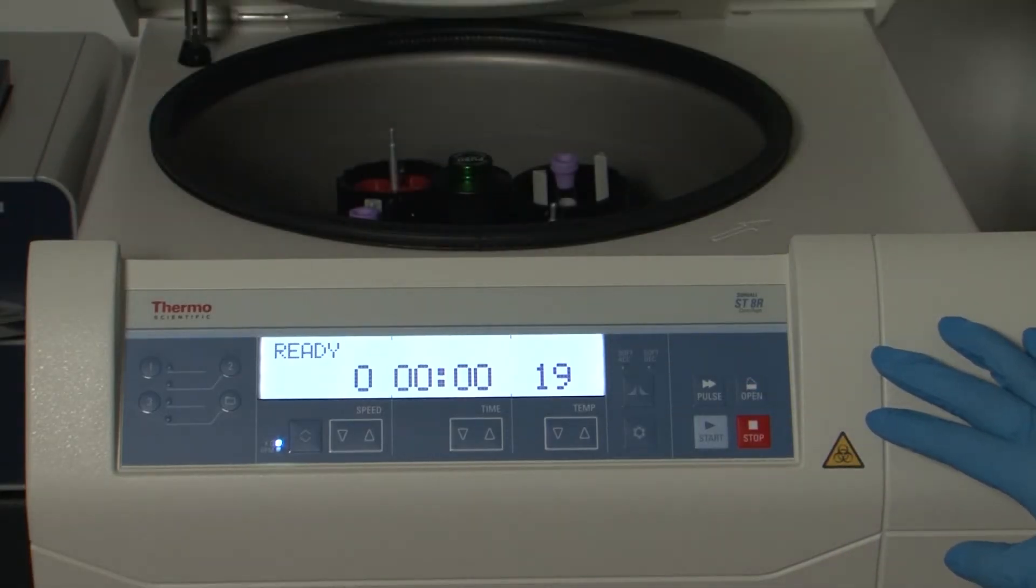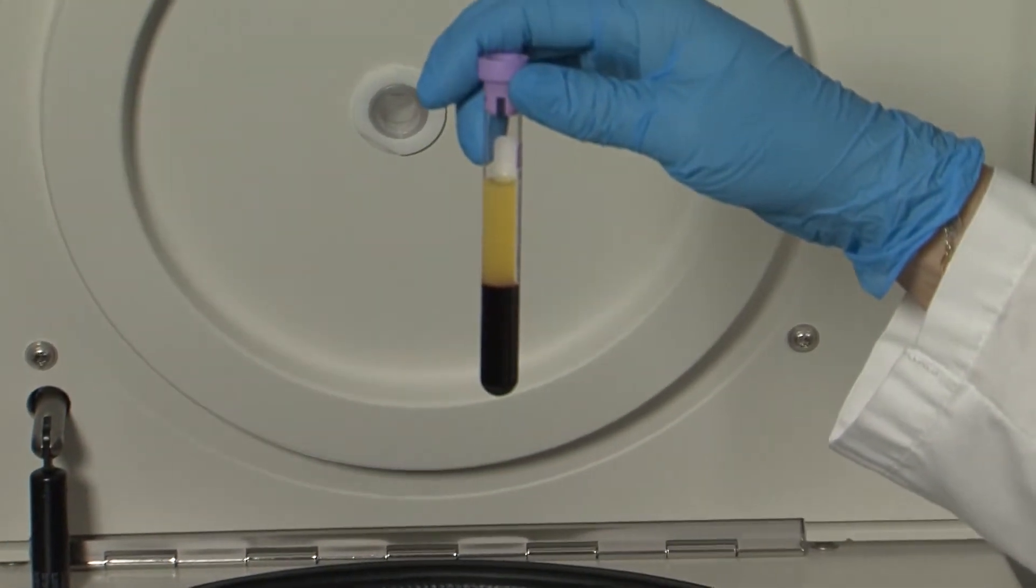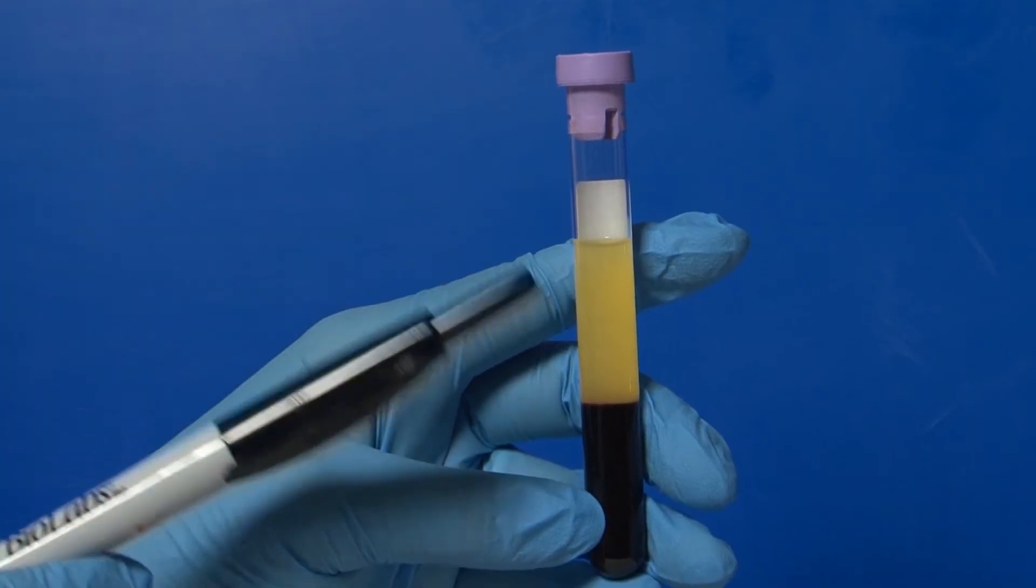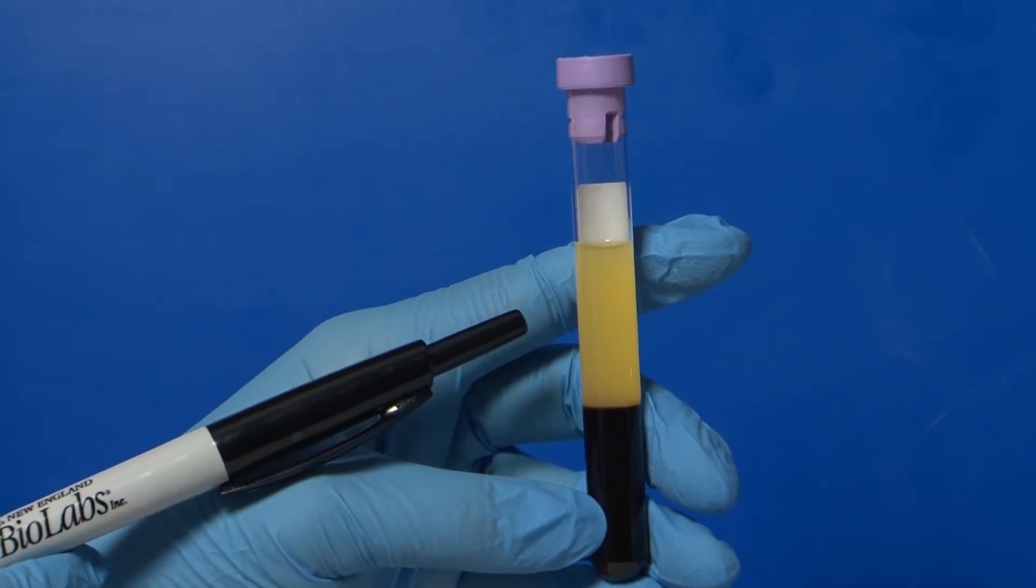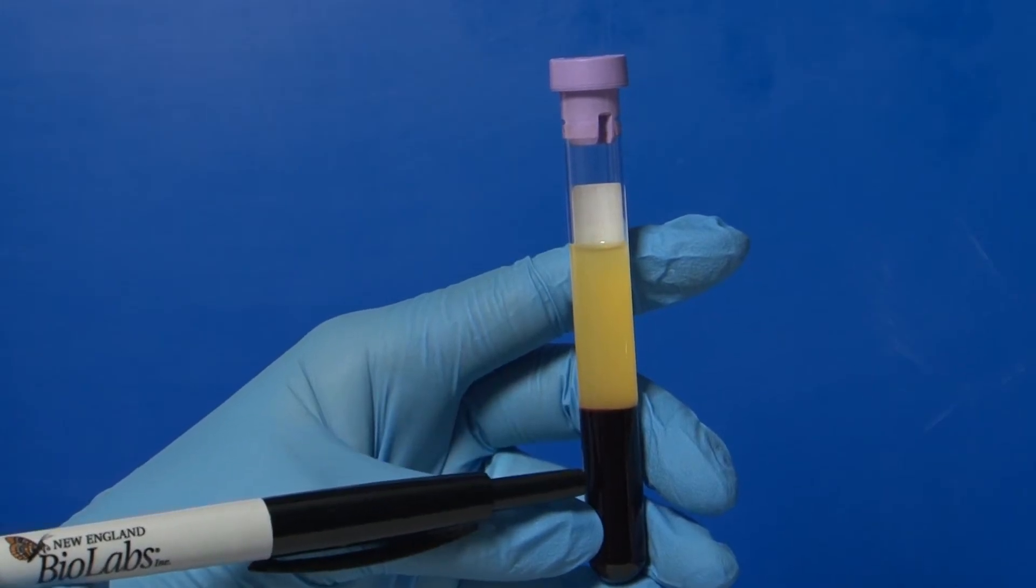Carefully remove the lavender top tubes so that the solutions do not mix. Three layers of blood components will be visible: plasma, which is the yellow fluid on the top, the buffy coat or white blood cells, and the red blood cells.